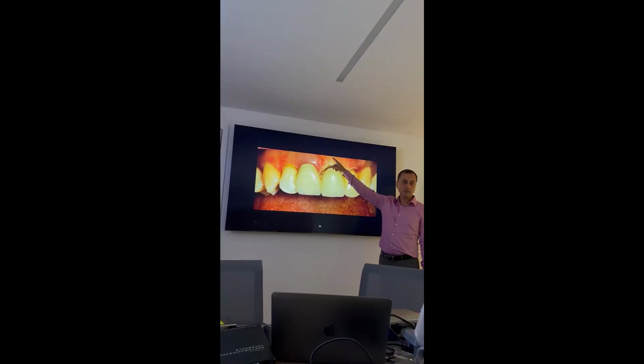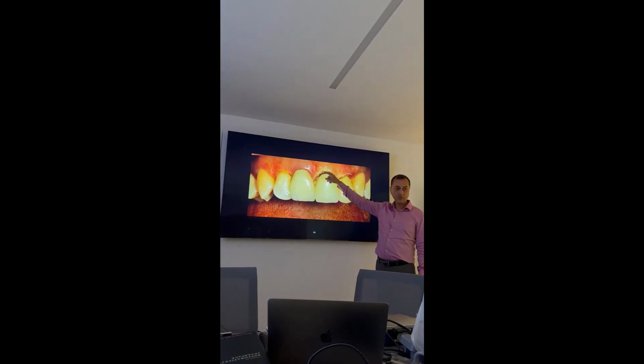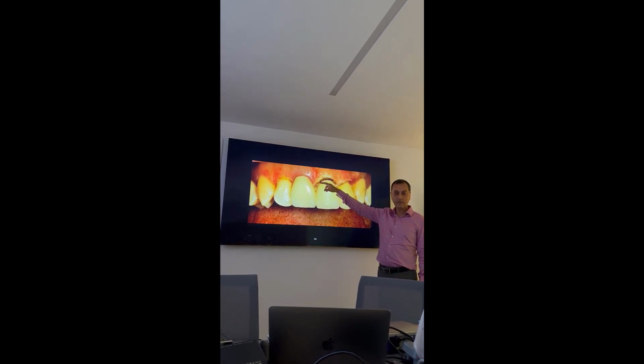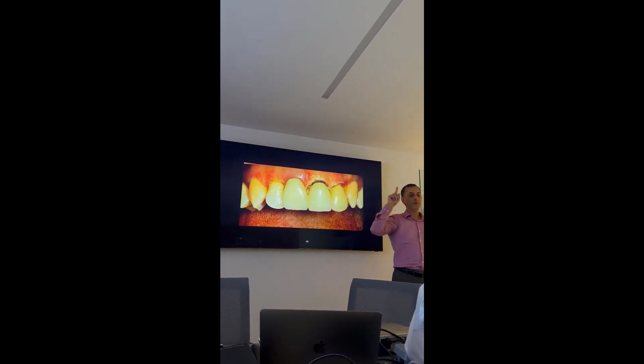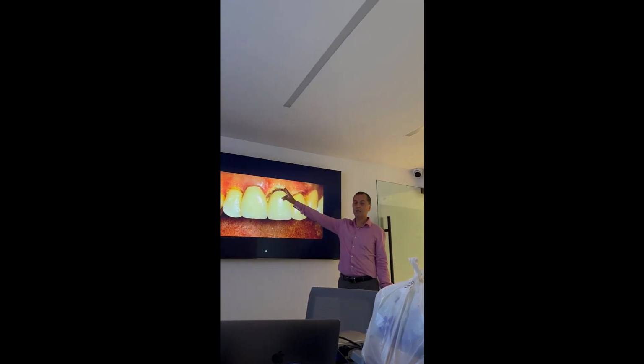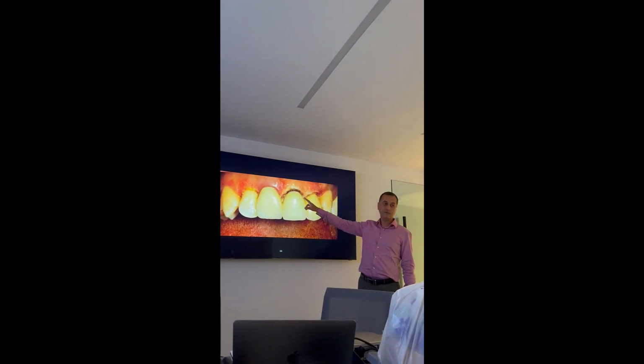And I used from here. You measure 3 millimeters of the bone, or if it's not, you're cutting the bone away. I prep the teeth and take the impression at the same time, because I know the tissue is going to be back again 3 millimeters away from the bone, from line angle to line angle. I'm not touching the proximal. You see here?